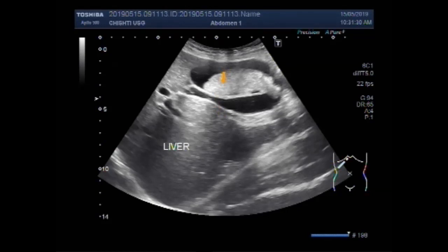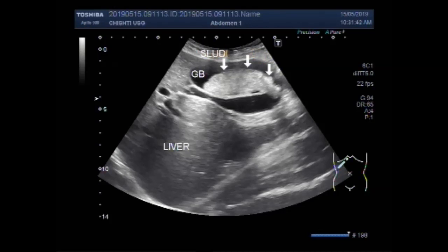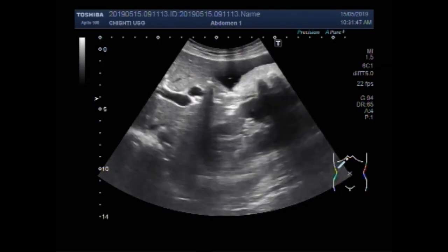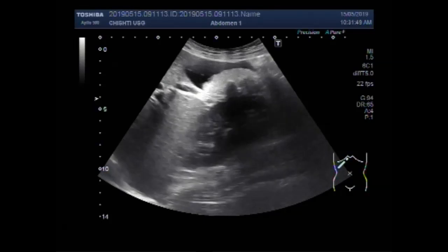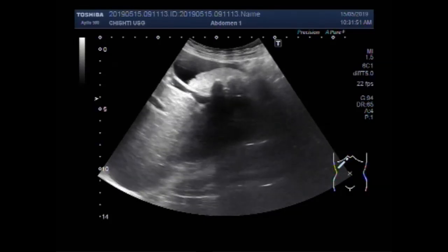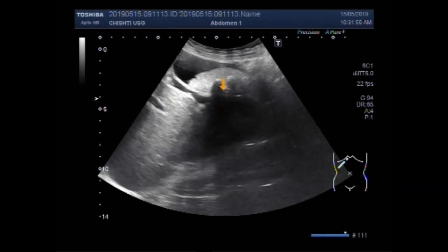This is the sludge ball and this is the gallbladder. This one is the sludge. Now you can see the gallbladder stones impacted in the thick sludge. The shadowing is visible.